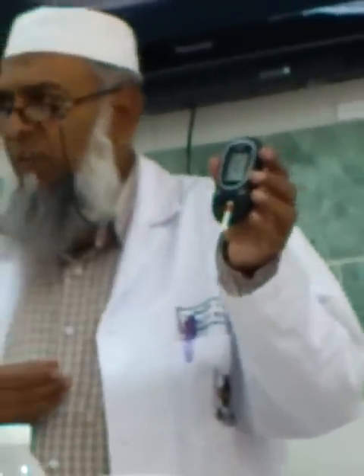The glucometer will start. First, 701, the coding chip number, comes, and now you can see a drop of blood starts flashing on the screen. When the drop of blood starts flashing on the screen, it means the meter is ready now.